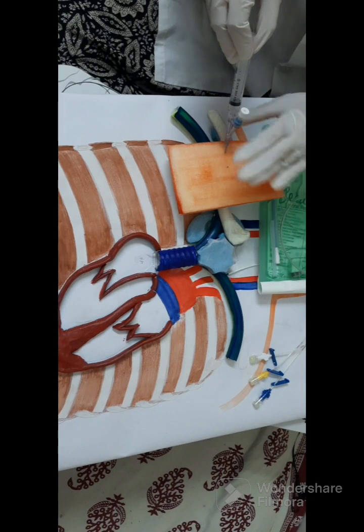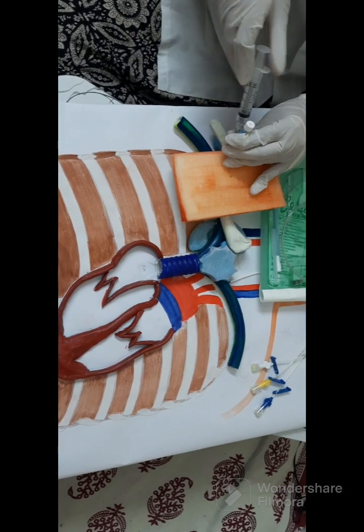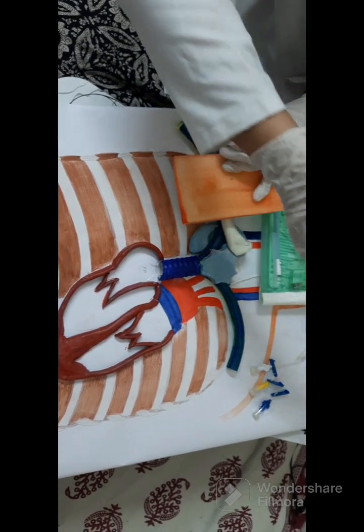Now we will reposition our left hand and firmly grasp and anchor the needle hub. When blood freely aspirates in the syringe, we will remove the syringe and immediately insert the J-shaped guide wire.